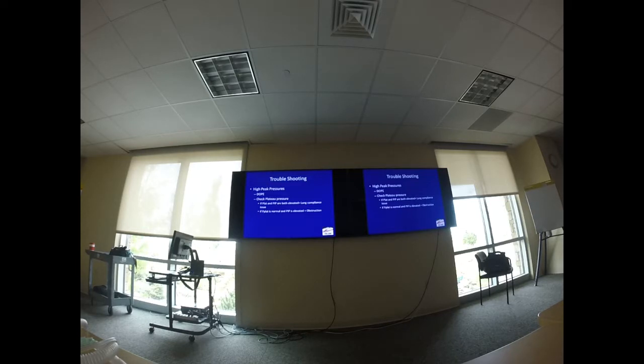I think it's those cases where you get acute respiratory distress syndrome or an asthmatic or something like that, that you need to titrate different things. But for the most part, I think it's fairly vanilla when you put a patient on a ventilator. I mean, you might adjust your PEEP depending on your congestive heart failure patient. Like Bert was saying, you might want to start with a lower PEEP with an obstructive disease. But for the most part, it's fairly vanilla. You guys all good?